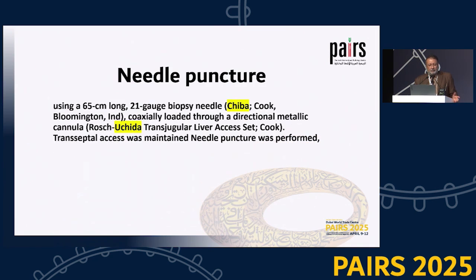Now, needle puncture is easily done, but you have to be very, very meticulous to know exactly what you're puncturing, because the problem here is sudden death on the table. You wouldn't be able to regain if you put the needle in the wrong place at the wrong time.